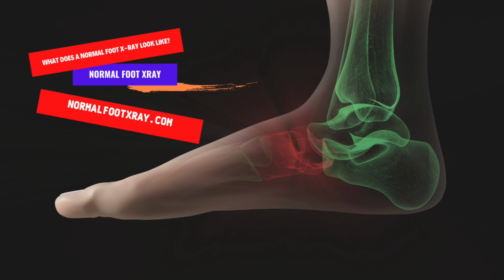The X-ray of the foot can be taken at any time, and there is no need to prepare for it. Children may be asked to remove certain clothing, metal objects, or jewelry. If you are pregnant or breastfeeding, you should tell the technician before the procedure. During the process, you might feel uncomfortable for about 15 minutes. However, the exposure to radiation is minimal and will last only a few seconds.